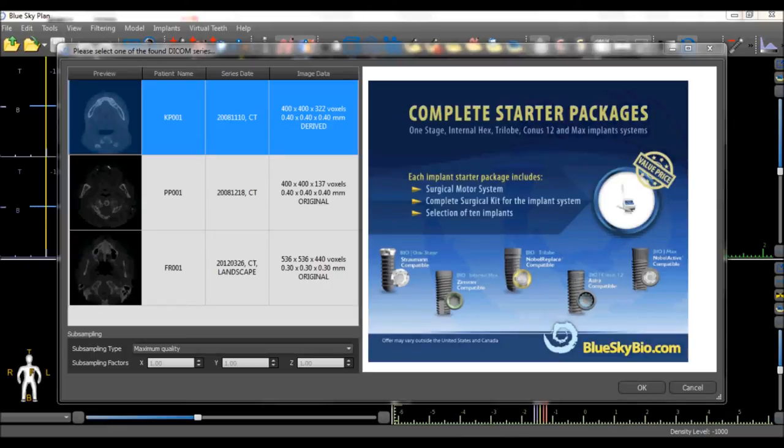After pressing the OK button, the software brings up a dialog box displaying the different sets of DICOM images which were in the selected folder.